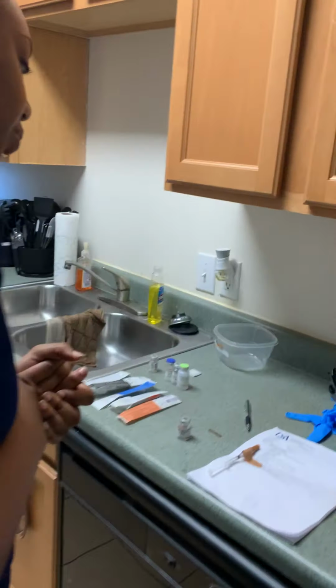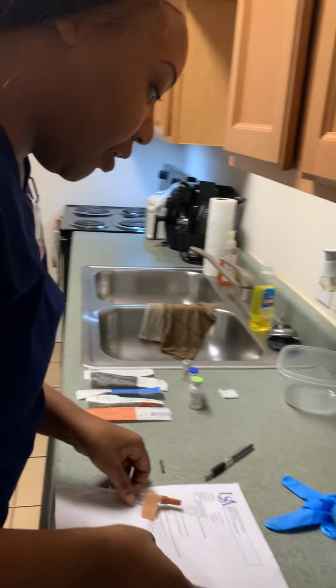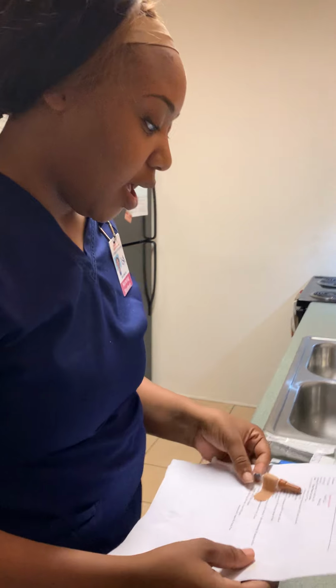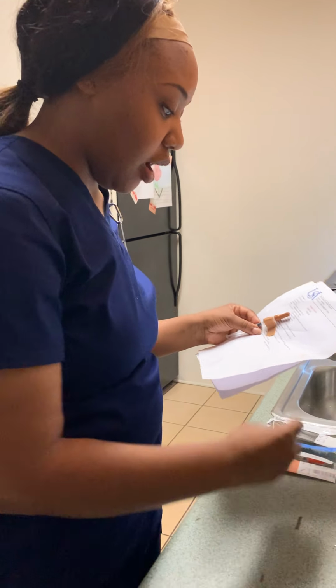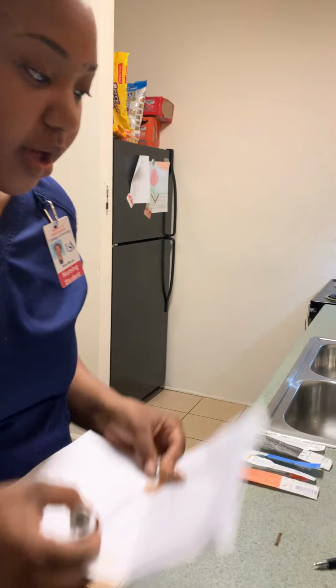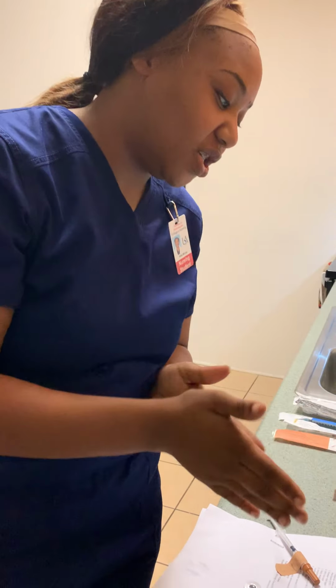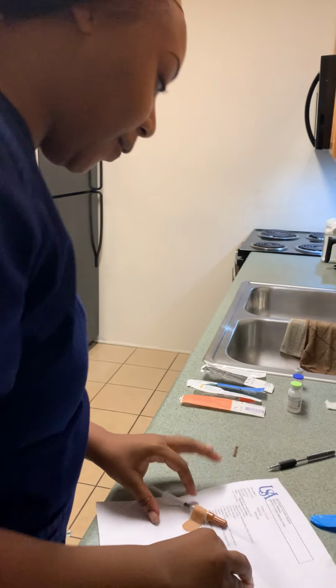All right. Thank you. Next, I will go on to my patient's room with my paperwork as well as my injection, and I would also take my vial with me. I will go into the patient's room, perform hand hygiene, and make sure that I have the right patient.